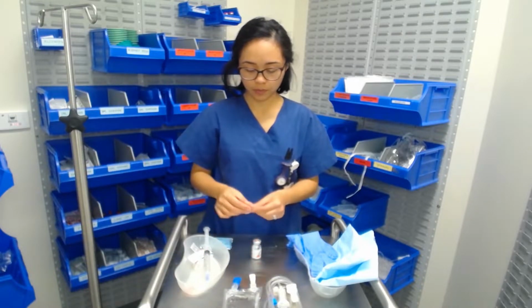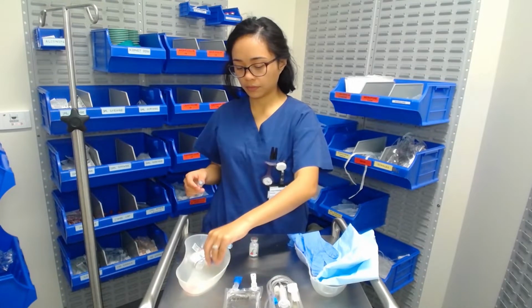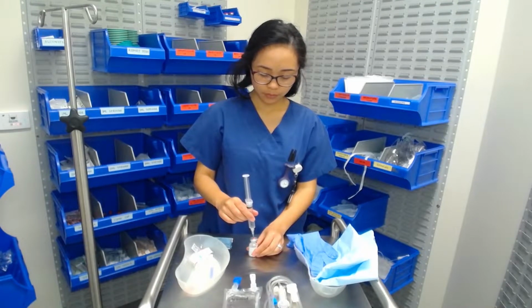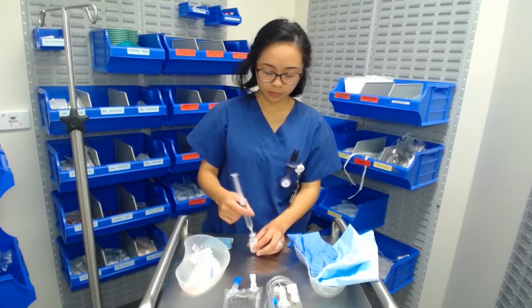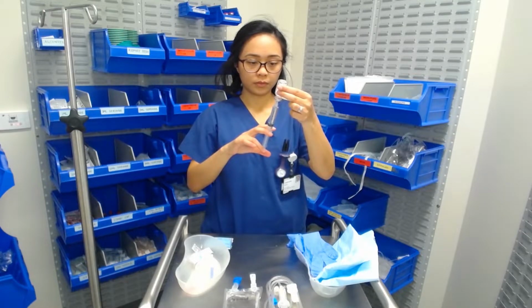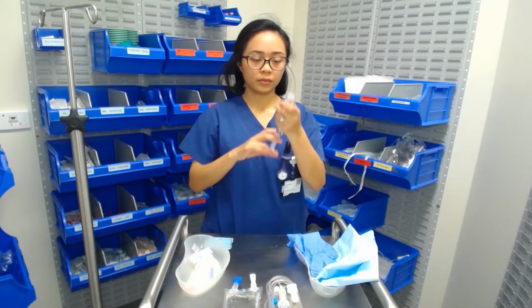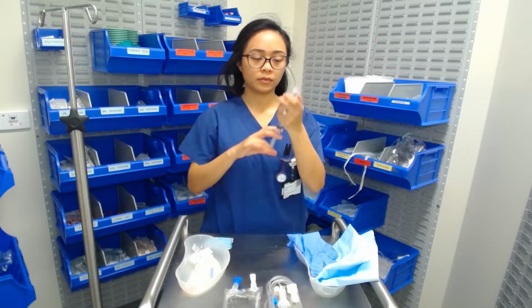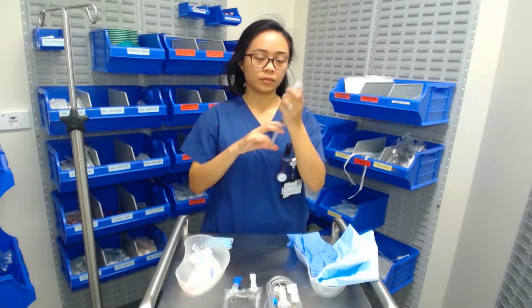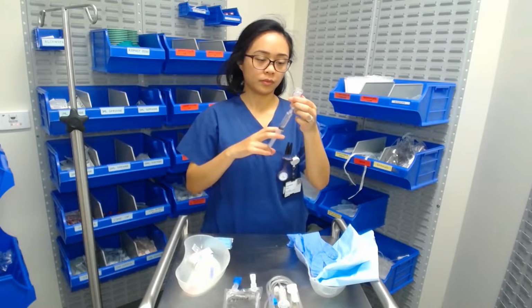I've attached my vial access cannula, which again is not a sharp. I've opened the glass vial ampule lid. I've just swabbed it with an alcohol swab as well. And I've inserted my diluent syringe. I'm just placing in a few milliliters of my diluent into the glass vial, mixing it, making sure everything is diluted, and I'm drawing back.